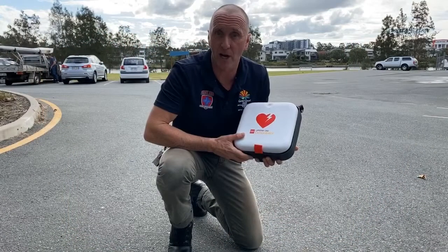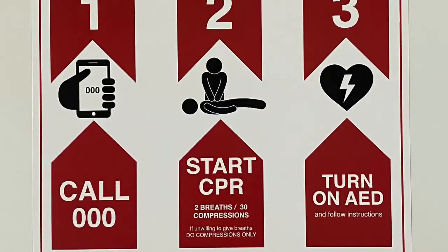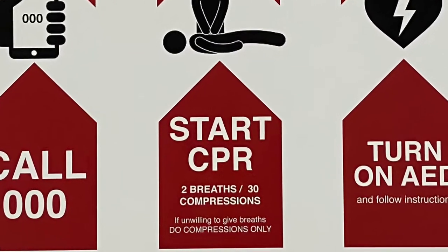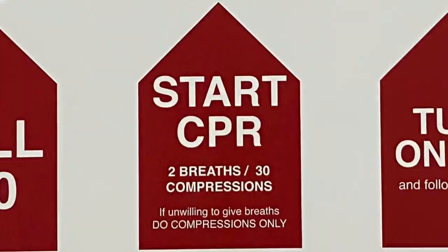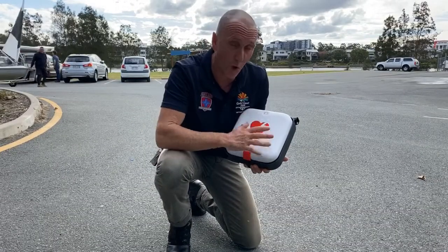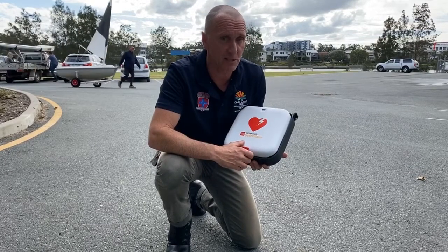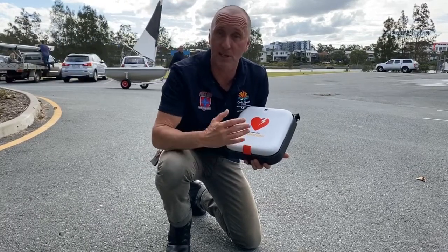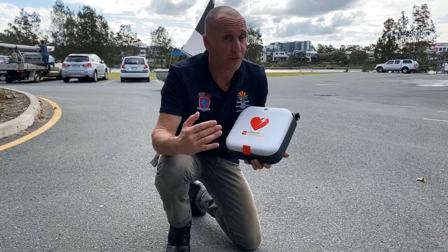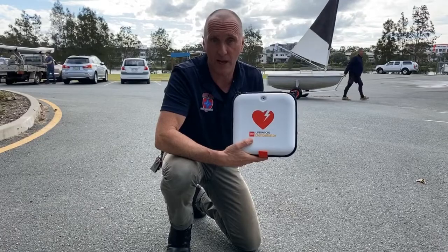Step two in the chain of survival is starting CPR on your patient. This is designed to build blood pressure and prevent brain damage while the defibrillator is being applied. You can either do compressions-only CPR or breaths and compressions if you know the patient. The final step in the chain of survival is putting the CR2 defibrillator onto your patient.